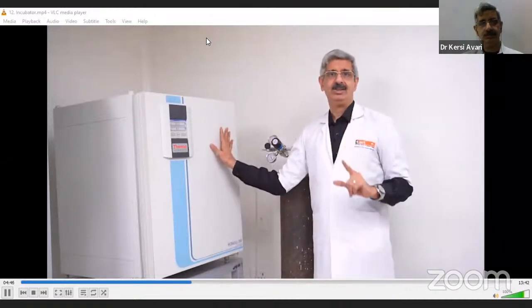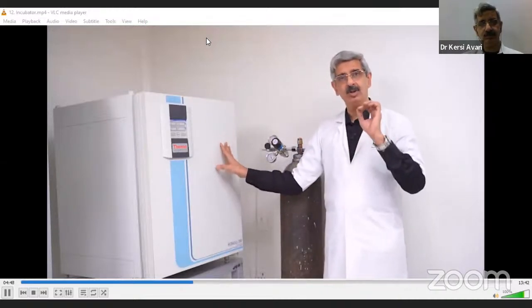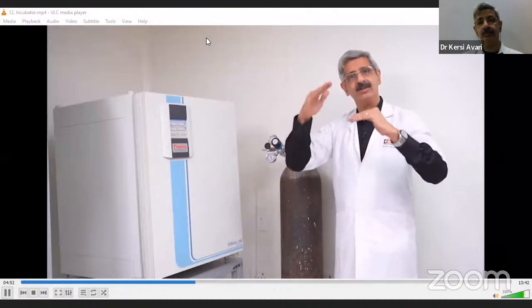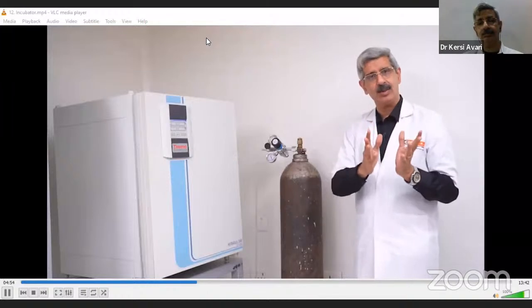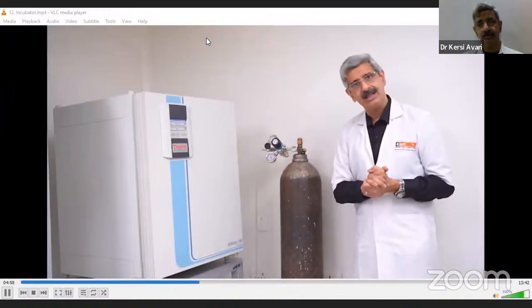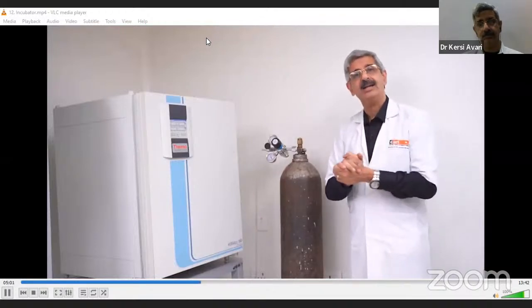Incubator is an exothermic gadget. It will work well in an environment which is cool. There has to be a temperature flux difference between the existing environmental temperature and its functioning temperature. So ideally, cooler labs means higher efficiency.